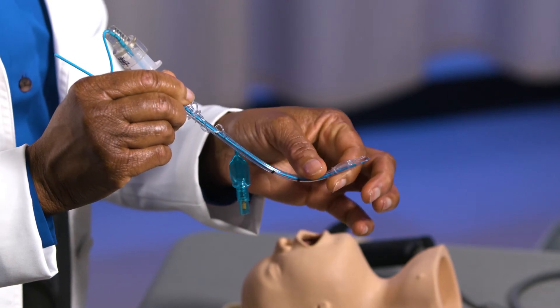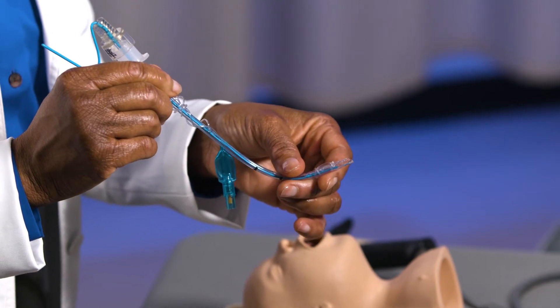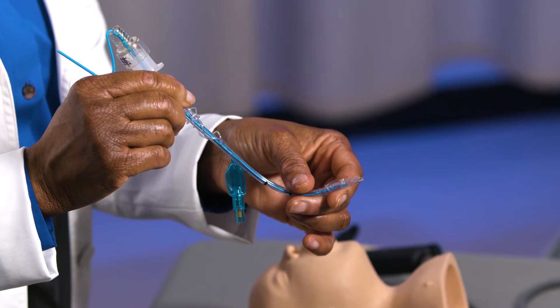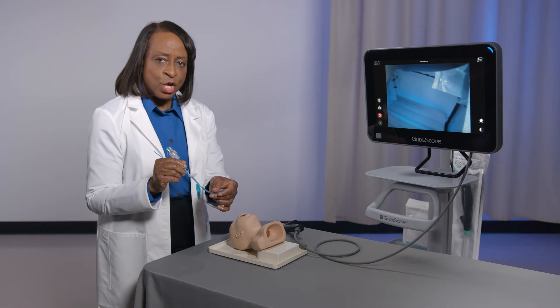I usually bend the malleable stylet slightly after inserting the endotracheal tube. It may also be useful to already have a stylet in place in case you choose to switch to a hyperangulated blade. In that case, you can simply adjust the curvature of the stylet to match the hyperangulated blade shape.